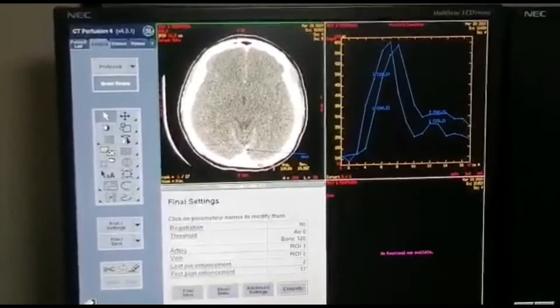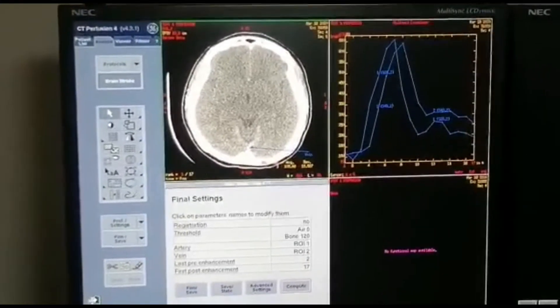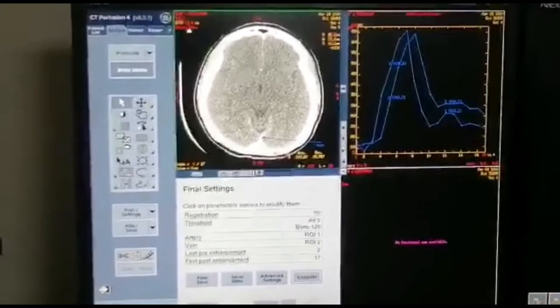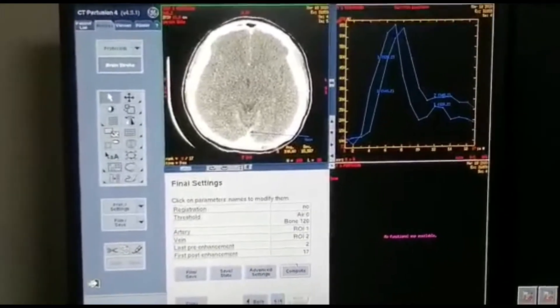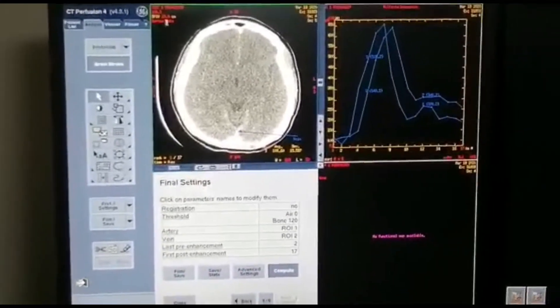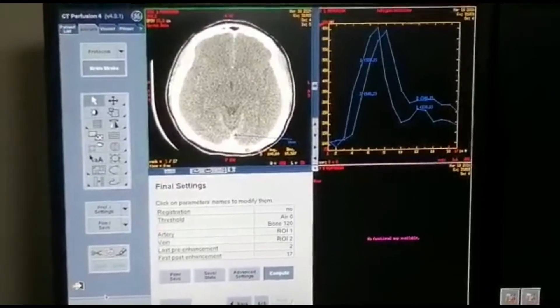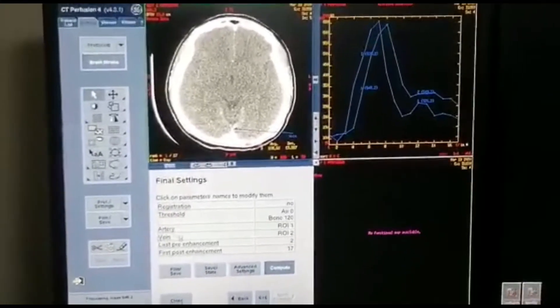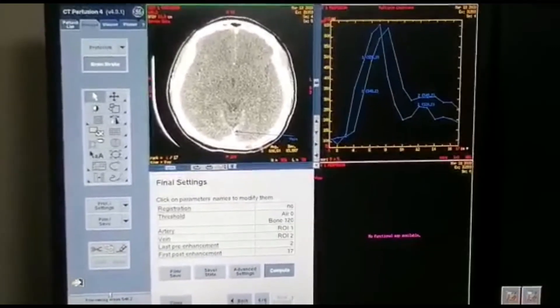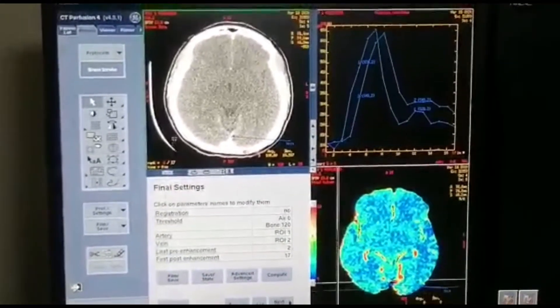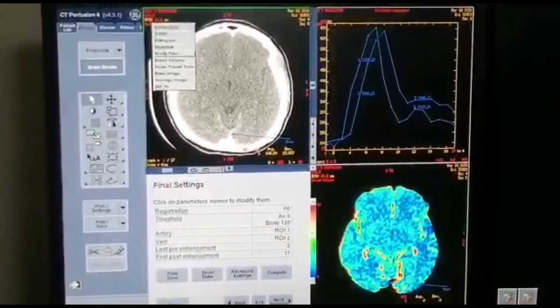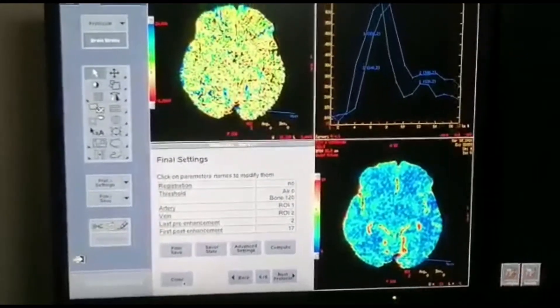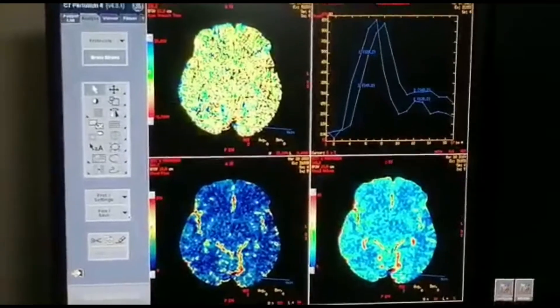Click next again. You need to change this one to compute — compute once first — and then change this one to mean 20 times. Yes, so we have the R3 and the vein, and then mean 20 times.